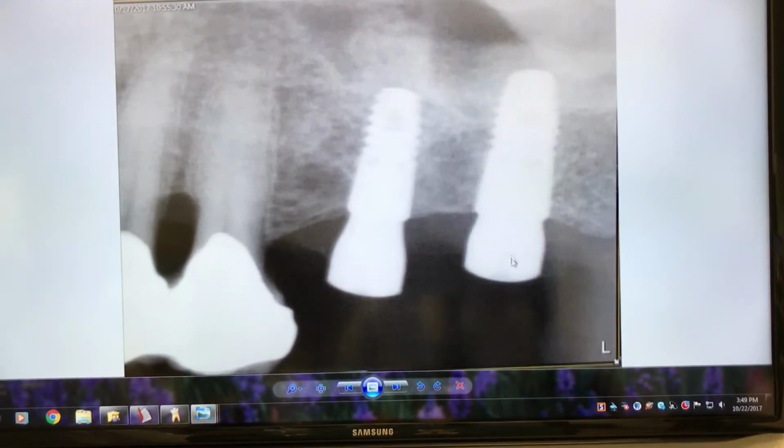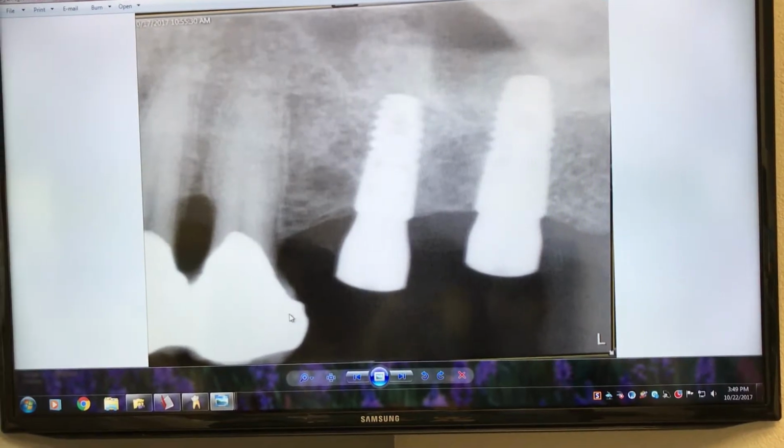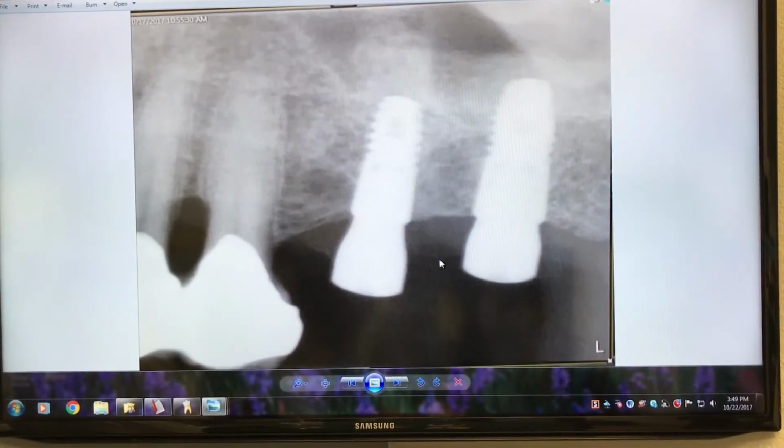Now, after 5-6 months, we can get in there and put crowns on these two teeth. And the patient will have two separate teeth here that he can clean in between easily.